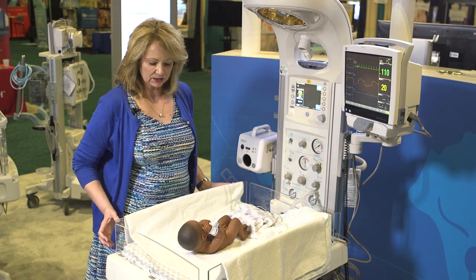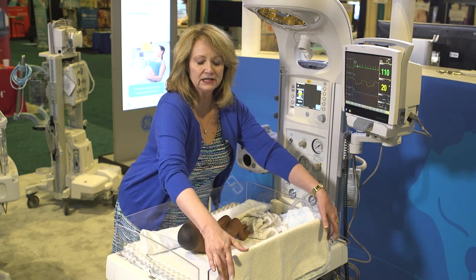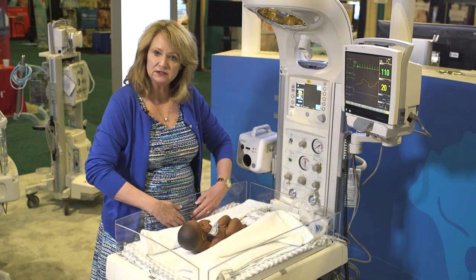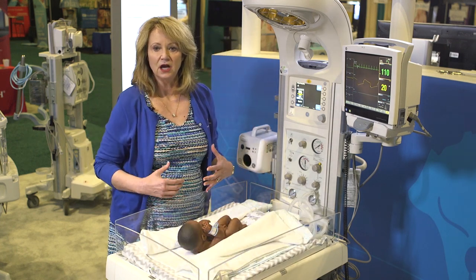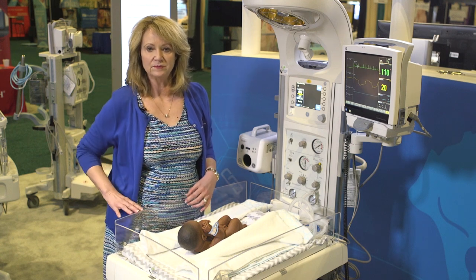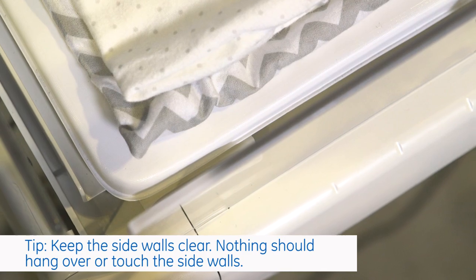Once you are ready to weigh, you want to make sure that all of your blankets are on top of the mattress. You don't want anything over, touching, or laying over the sidewalls. There may be times that a stethoscope might have been draped over the sidewall, or maybe tubing — anything like that. You want to make sure that the bed is completely clear.